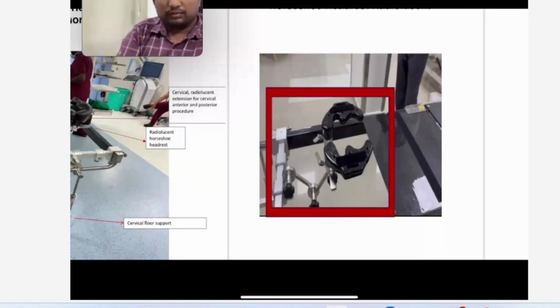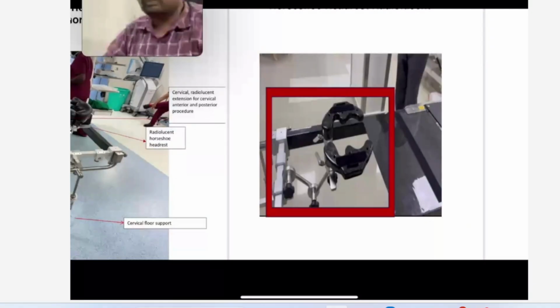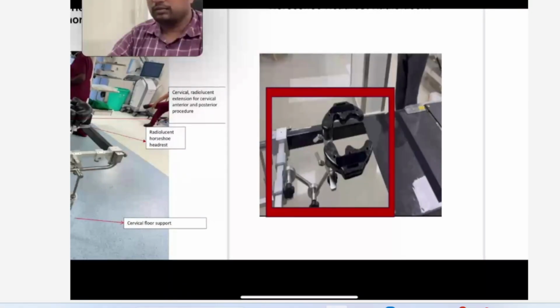So I decided why should I throw it. Basically, carbon fiber is not spoken about much in India or in our biomedical community. In our biomedical engineering stream, we never talk about these small nuances, which are more important. You may have a better CT machine from GE, Philips, or any company, or a better MRI machine from any big company. But finally, if you don't have a carbon fiber based top, you can't do imaging. You can't lie down the patient. That is what we always miss out.